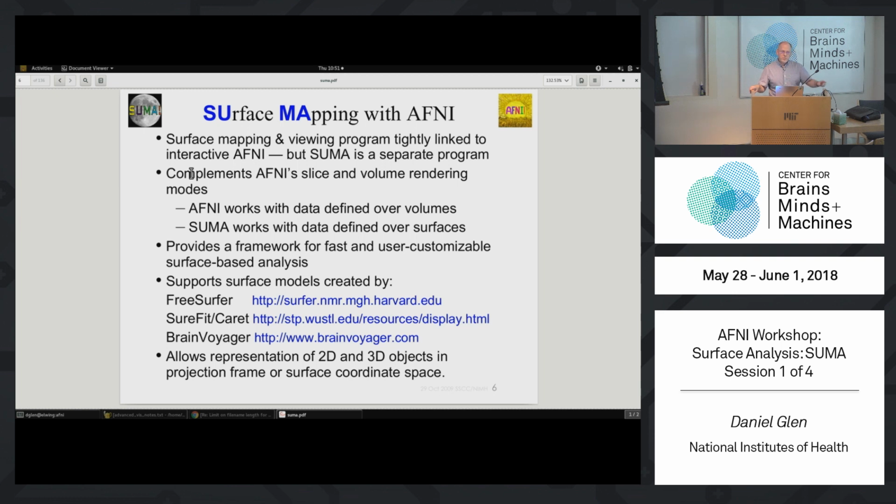The Connectome Workbench, a lot of the things are in CIFTI. CIFTI, yes, another one, because we need more file formats, yes. So CIFTI is a combination format. I forget what CIFTI actually stands for, but it's with a C. Rick will know because he was part of the committee, but he left the room just in time.